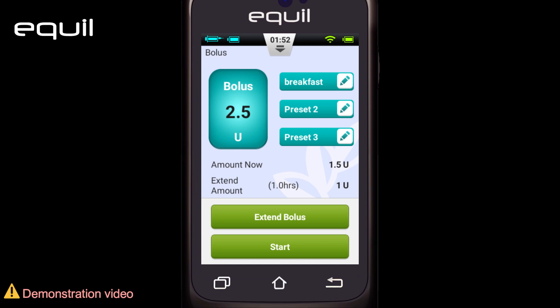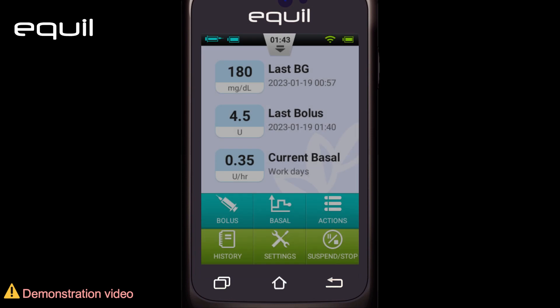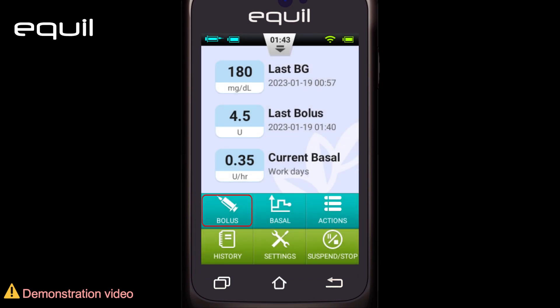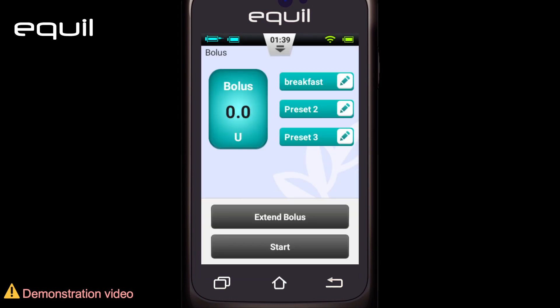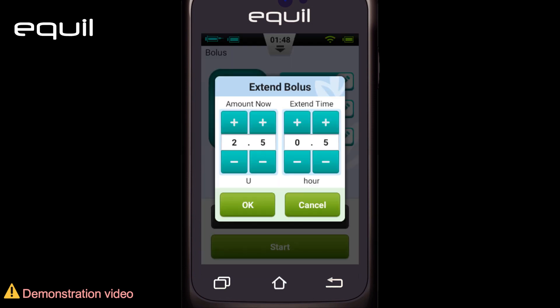Extended boluses are delivered in two stages: the amount now, which is administered immediately, and the rest over an extended period of time. To start using the extended bolus option, first we determine the bolus amount as before. And before starting, press 'Extend Bolus' to open the extend bolus window.